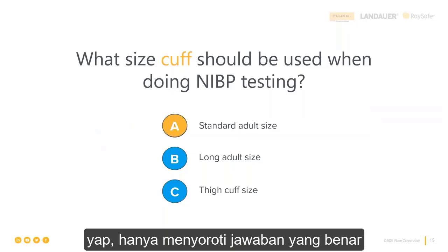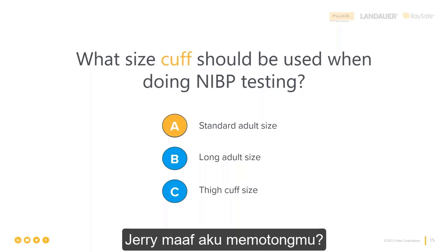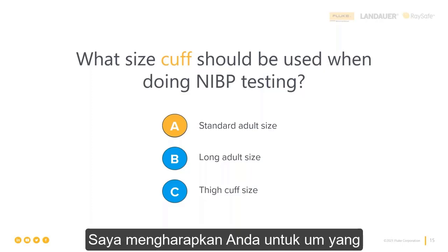Yep. Just highlighting the right answer there. 93% of you got that right. The standard adult size is what should be used. And Jerry, sorry, I cut you off. Feel free to elaborate. Okay, I expected you to.